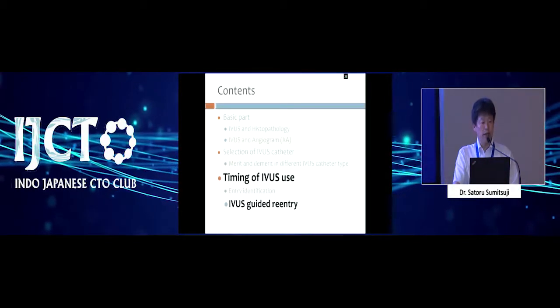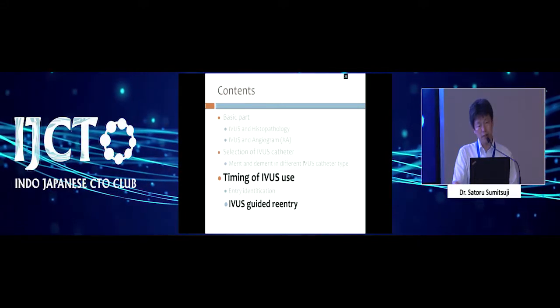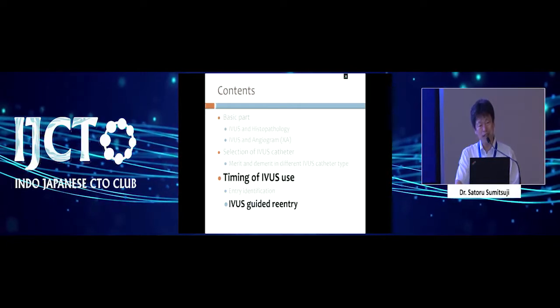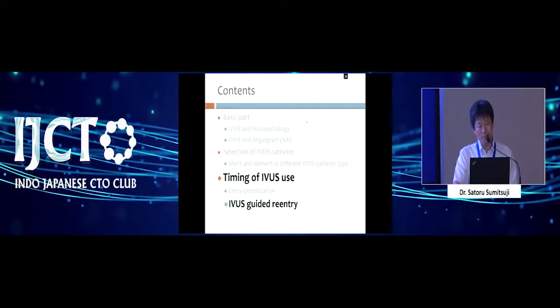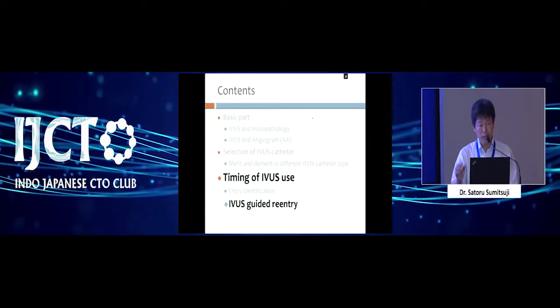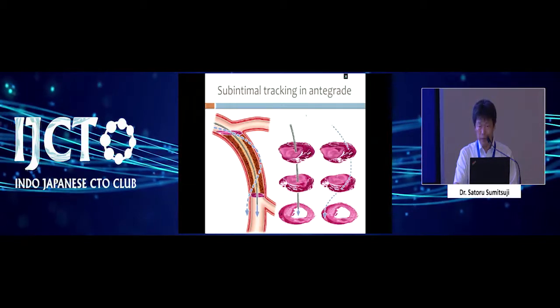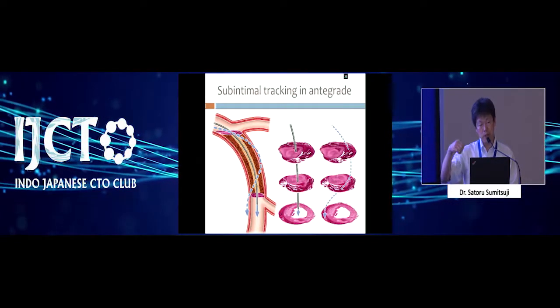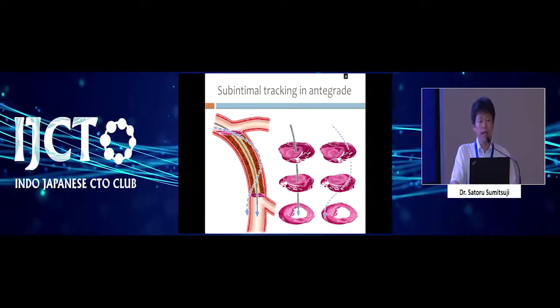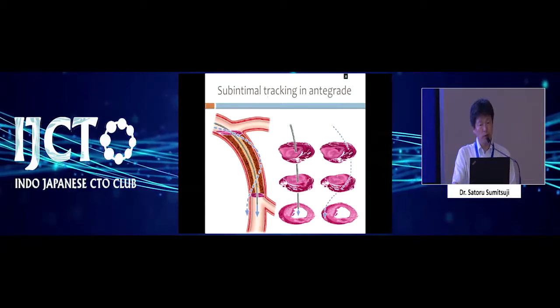Another use of the IVUS is more complicated, but it is the IVUS-guided re-entry. Maybe ADR is much easier and maybe better. I have very small experience of ADR, because I have the limitation of using the ADR device. Anyway, with the IVUS, even if we don't have the ADR system, we can do the re-entry with a higher success rate than just a lucky procedure. So what is the problem?